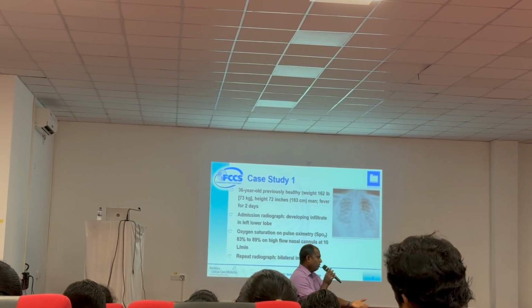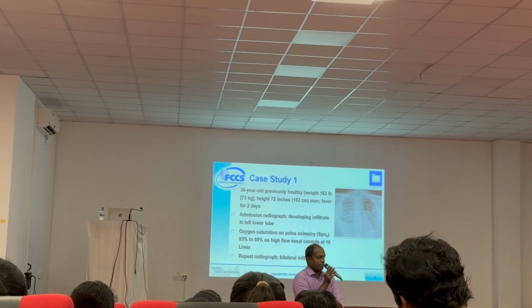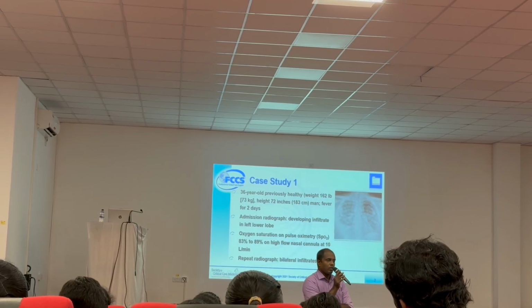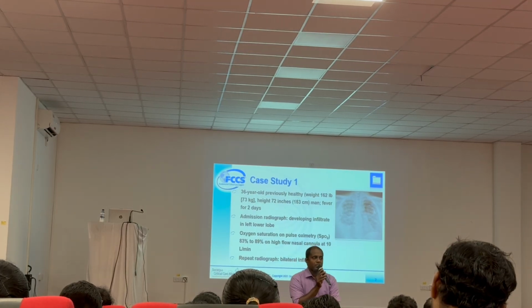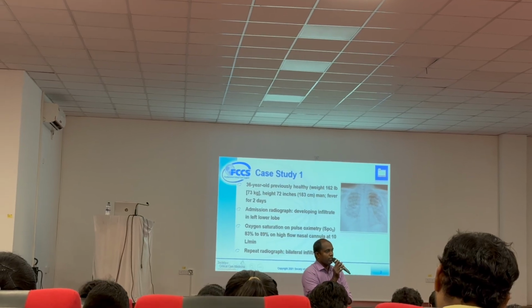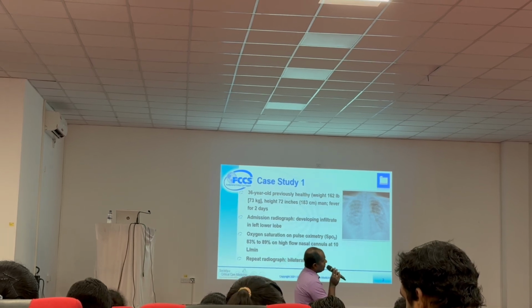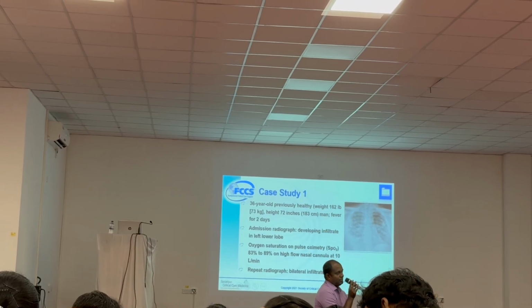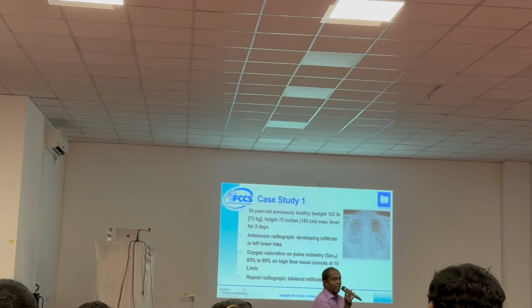You can download it on your mobile phone and see, okay, this much PEEP, how much FiO2 I need to set to get the target saturation. Third one, always keep more inspiratory time. The more time the patient is in the inspiratory phase, the more oxygen is delivered. But what problem will happen if the patient is more in the inspiratory phase? Air may not escape, so CO2 can be retained.